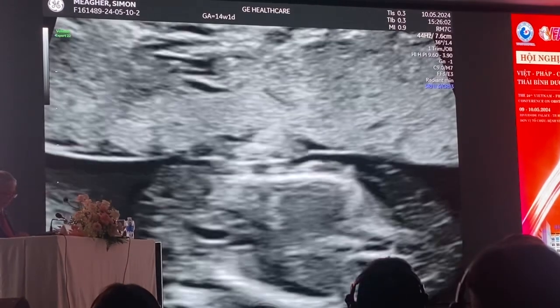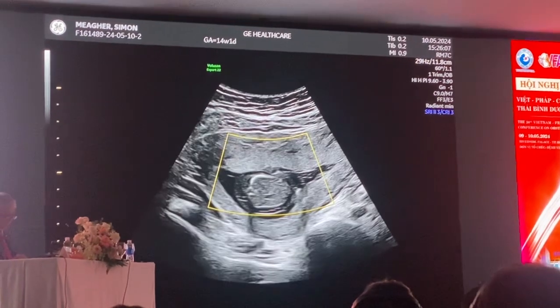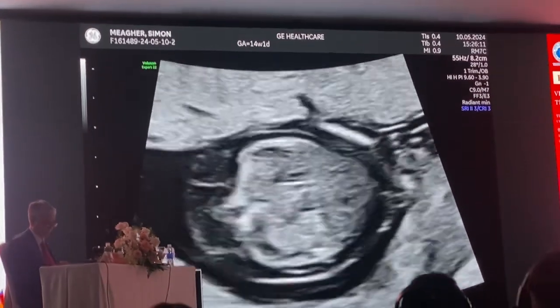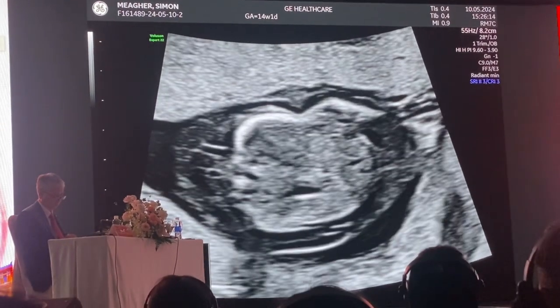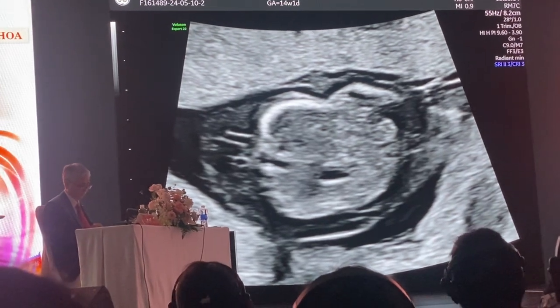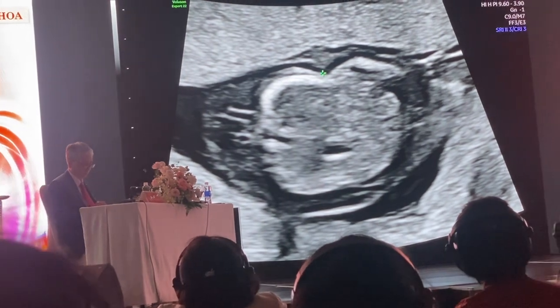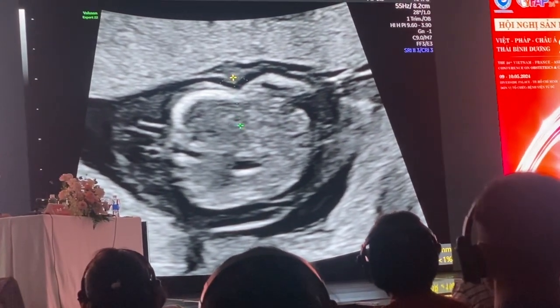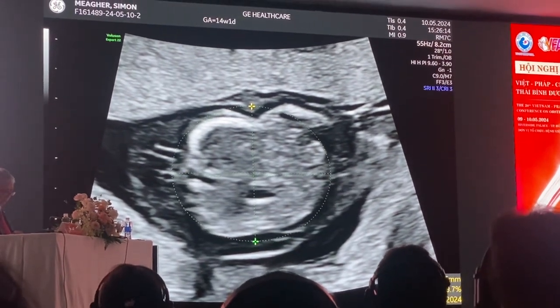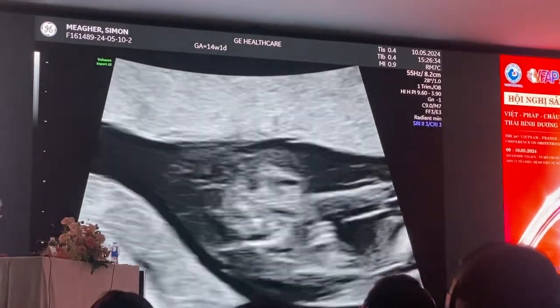So as I come down from that, I'm going to come down to the abdomen, and go to the level of the fetal stomach. Now this is going to be a difficult measurement to take because when you look at the abdominal circumference, if I include the skin edema, I'm going to overestimate it. So in taking this measurement, I'm not going to include the skin edema. I'm going to include what I think is the representative abdominal circumference. Otherwise, I'll get a crazy measurement.